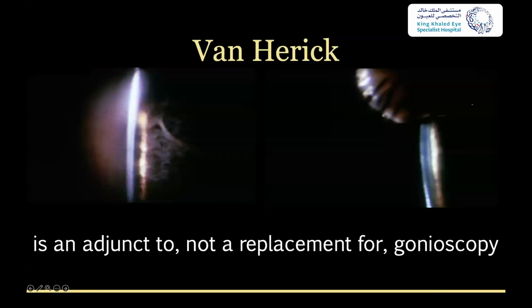So that's the corneal thickness, barely an anterior chamber in this one location, but there are areas where the iris is clearly touching the cornea right there and sort of sporadically through there. And then this is somebody whose angle is closed, right? There is no anterior chamber on Van Herrick in the periphery.